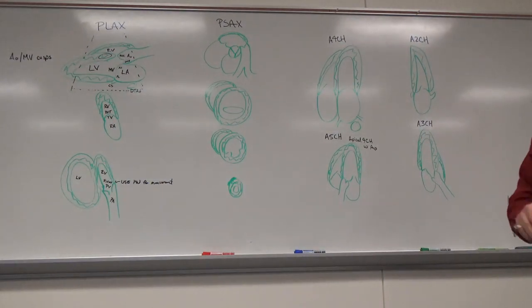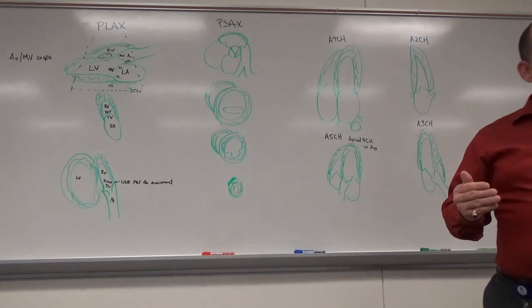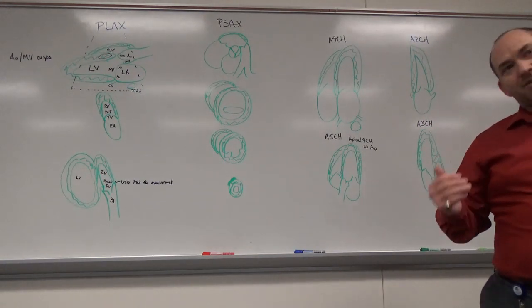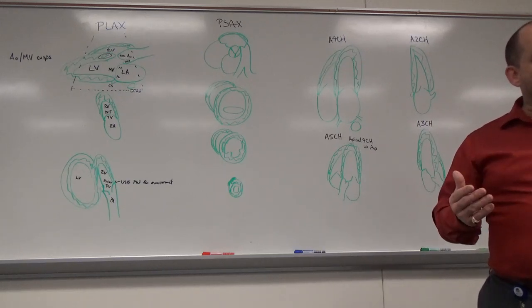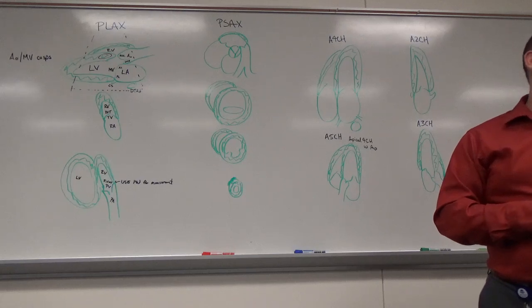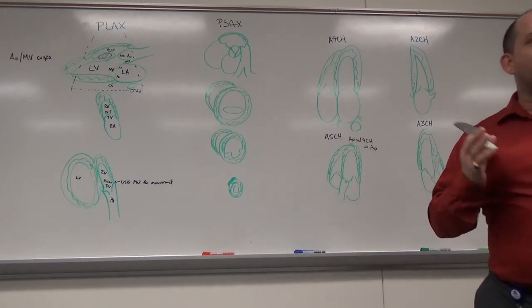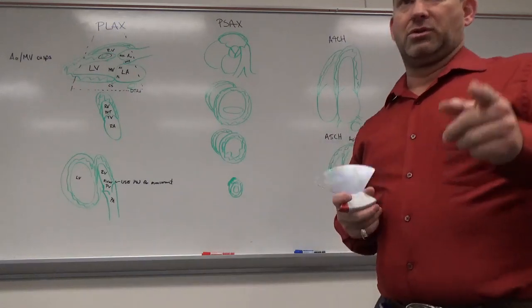Breathing, okay. I cannot emphasize enough in echo in particular how important breathing is, and I tell students this every year. And every year students get through, they don't do the breathing stuff, and then you come in the room, Tammy or I, it's like, okay, hold the breath, boom, the most beautiful view you've ever seen. Okay, breathing is absolutely critical in what we do.